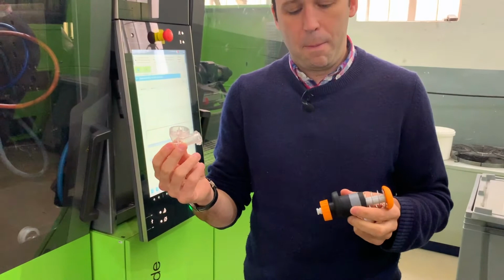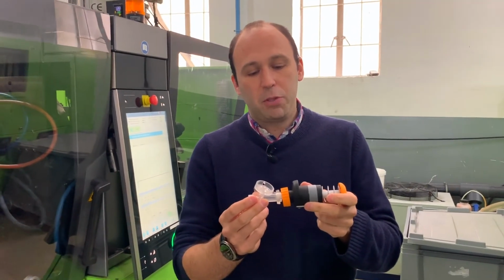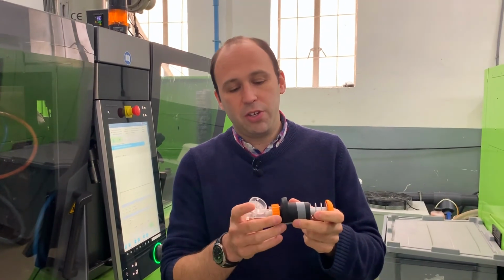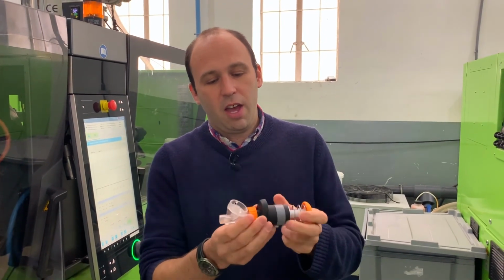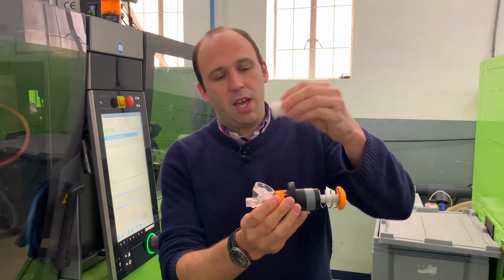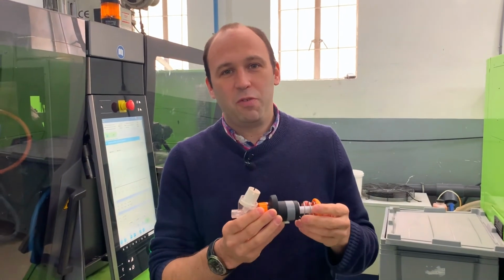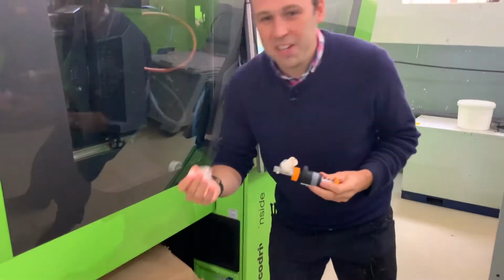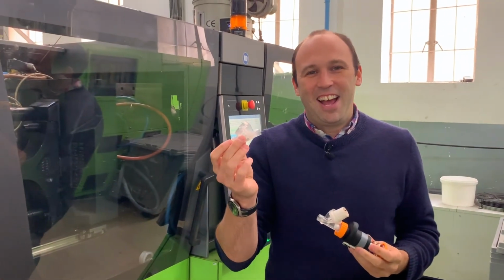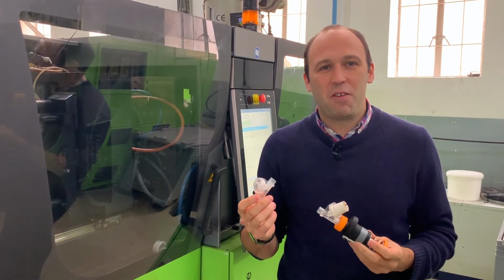What we've got here is a pretty crucial part of the whole assembly. It's been a massive amount of design engineering work into this. This part connects up with our dual stage injector and connects together both of that piece and with our quick change cartridge. So super exciting time. We're having parts come out of the machine and see our expensive injection mold tools coming to life and being commissioned up.